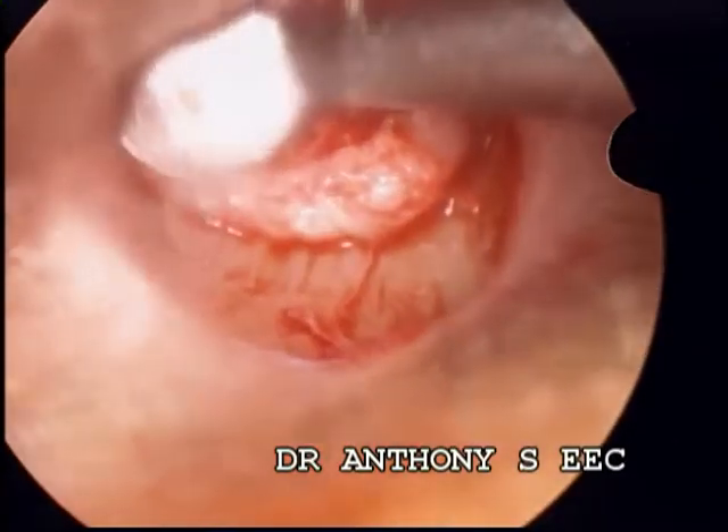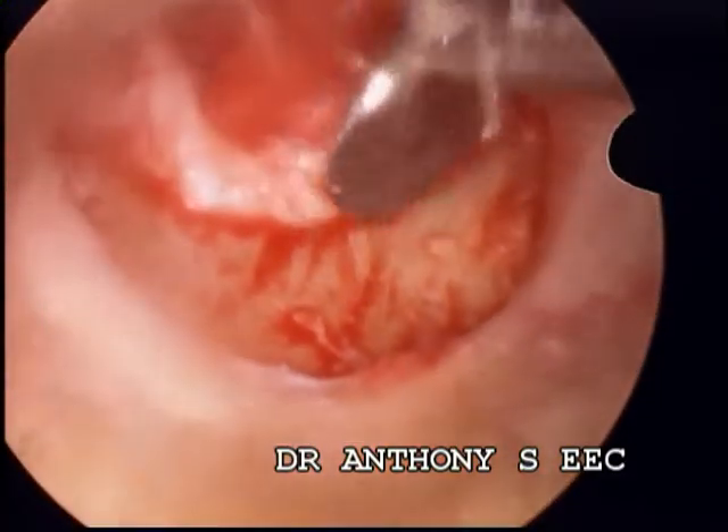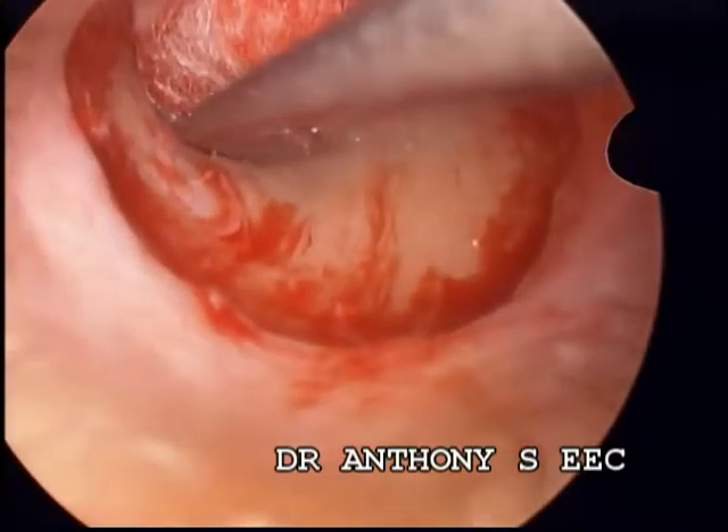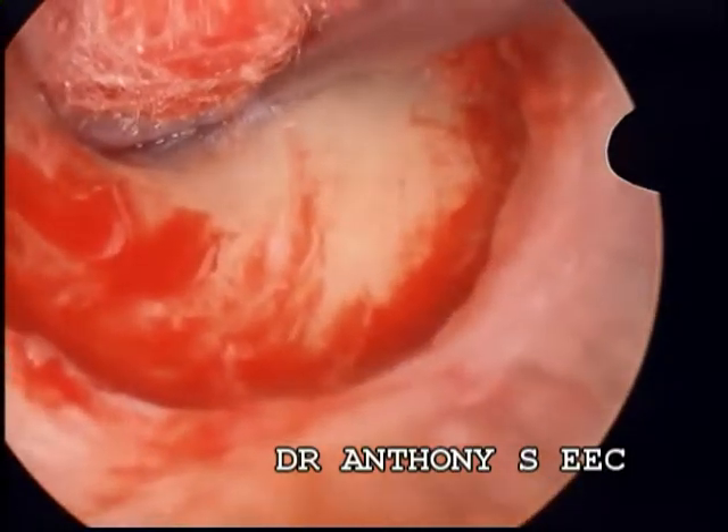This case is presented because of the fear that unexpected eventualities can be managed with an endoscope. To show that it can be, this video is presented.